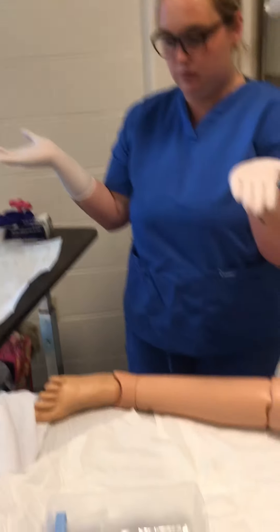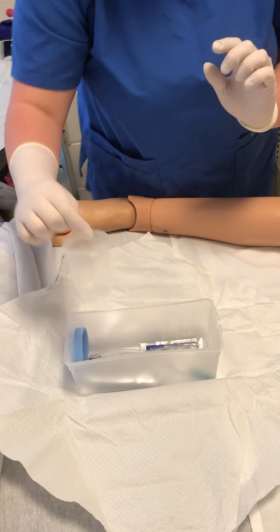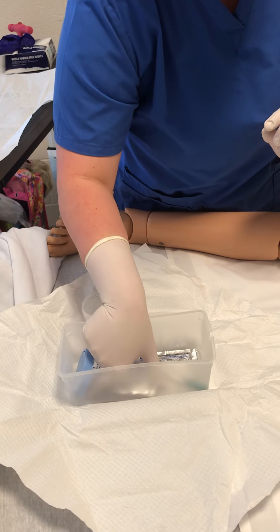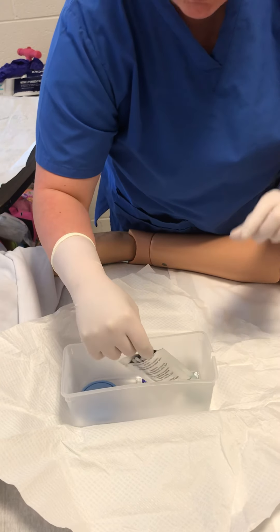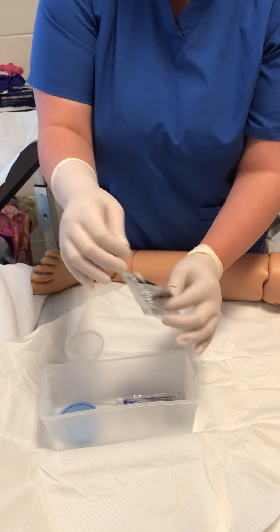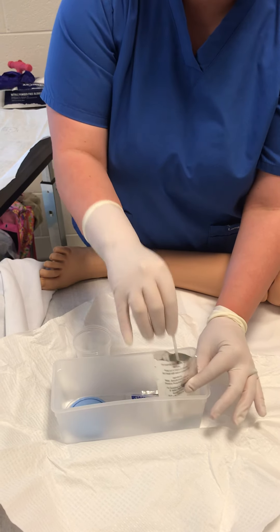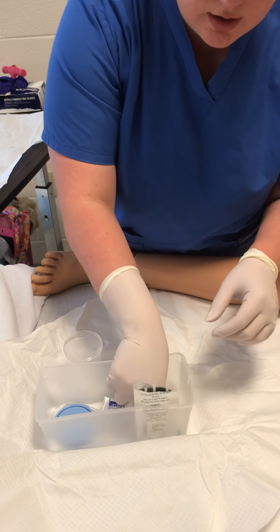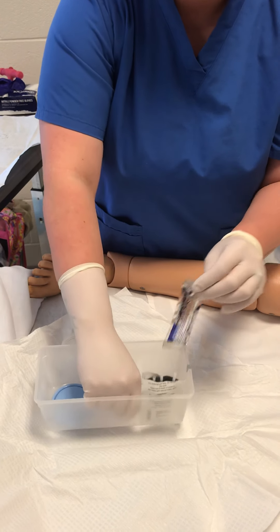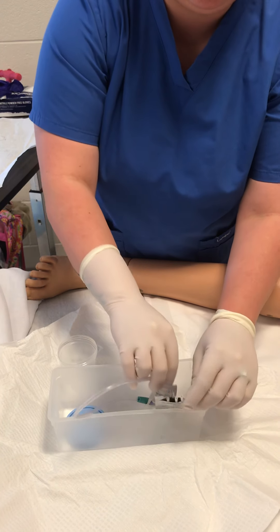Now my hands are sterile. I'm going to set the cup right here. I'm going to take my cotton swabs and open them, set them right here, and then I would open the lube — I'm not actually going to do it — but I would open the lube and stick the end of the catheter down in there and set it in here like this.